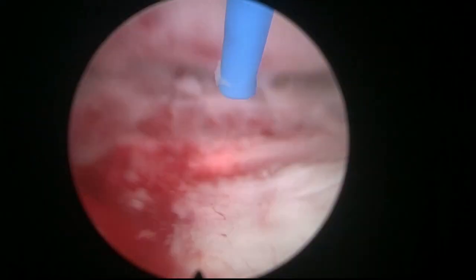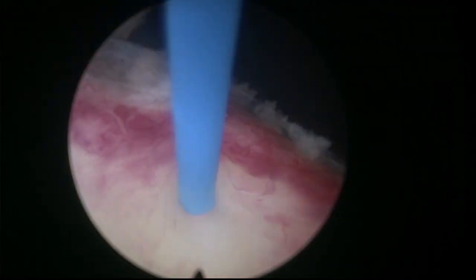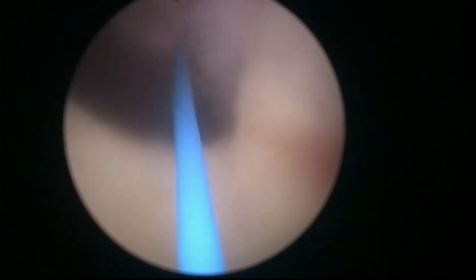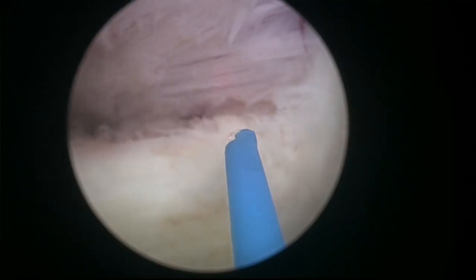Also, I have to say that the En-bloc approach is an approach that you can do with any source of energy. So here I'm pushing the adenoma into the bladder, initially one lobe and then the other lobe. So I try to flip the adenoma, you see here, here's the adenoma, now going into the bladder, hanging from this small pedicle at 6 o'clock.